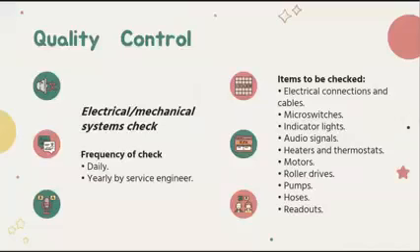Okay. We have electrical or mechanical system check. Frequency of check is it can be done daily or yearly by your service engineer. And then the items to be checked are electrical connections and cables. So dapat wala dapat nagsiwil na wires. No, dapat they are properly insulated.